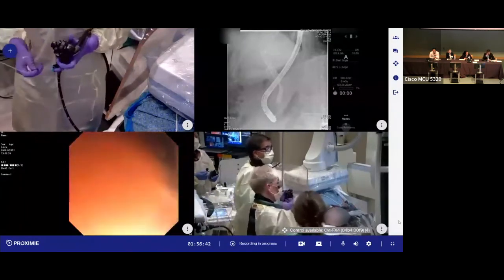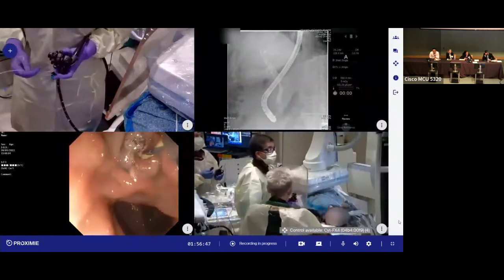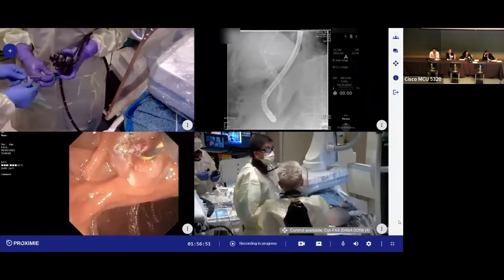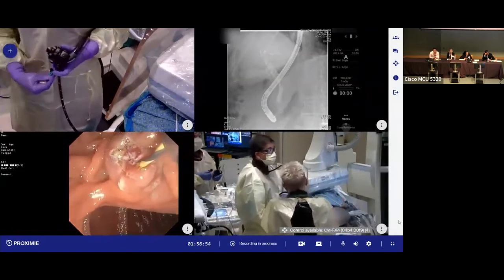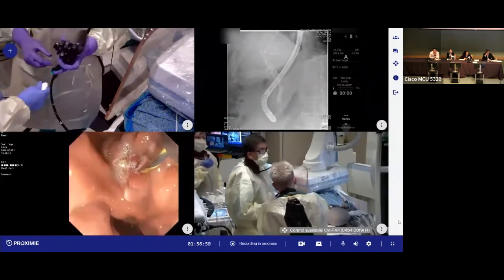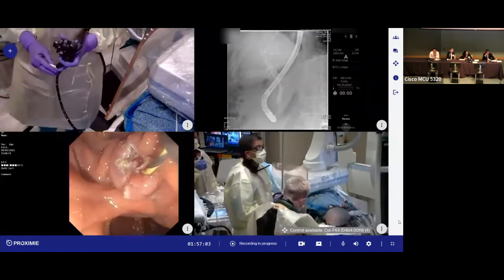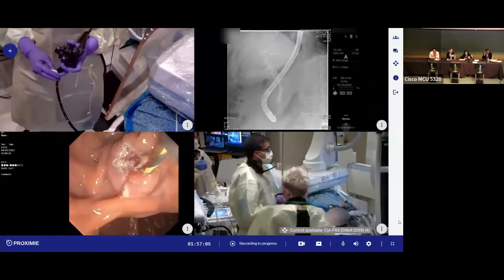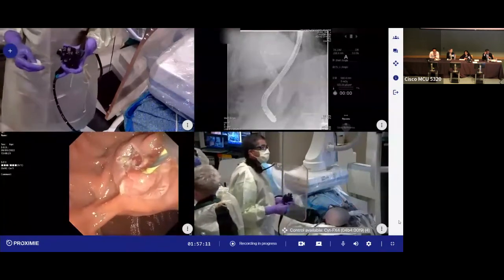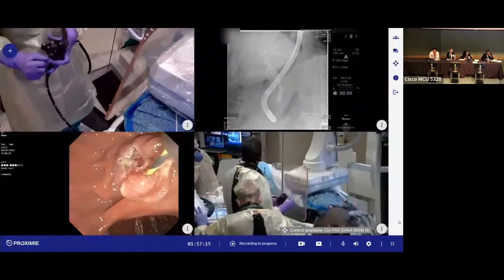Yeah, but I think I know what you saw in EUS, but the one that I thought was 10 millimeter could be 2 stones and they might come through. Okay, but I would say that we see this commonly, and Jeff, I'd love your opinion of the panel, of these patients that have chronic stone disease, which is what this is, and they get a fibrotic papilla. I'm wondering if some of that cautery effect wasn't just my suboptimal technique, but maybe it was partly related to the fibrosis in the papilla. Yeah, I agree with that.